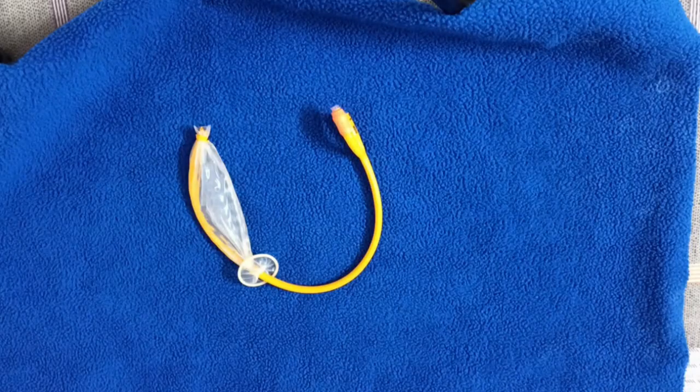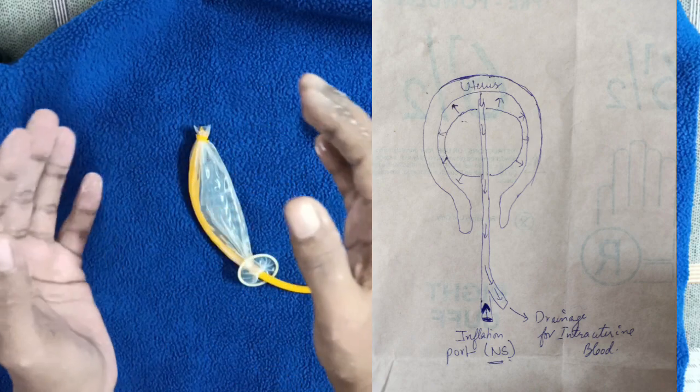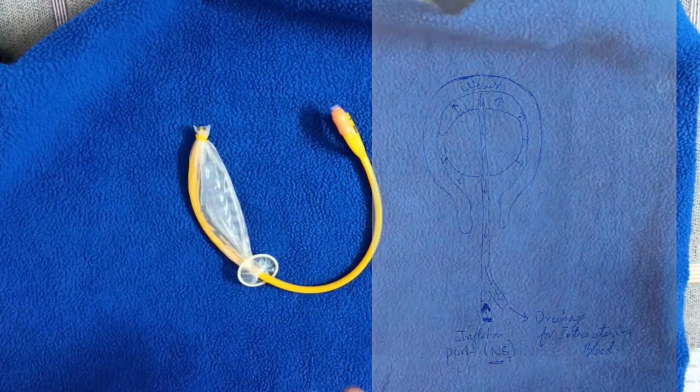The mechanism of this CG Balloon is to get inflated inside the uterine cavity, press on the uterine walls, and stop the bleeding. For insertion you require a Sim's speculum and sponge holding forceps. First clean the perineum and vagina to maintain a sterile environment. Then retract the posterior vaginal wall, catch the anterior lip of the cervix so the os is visible, and pass the CG Balloon into the intrauterine cavity. After that, pack the vagina with gauze to secure the balloon.